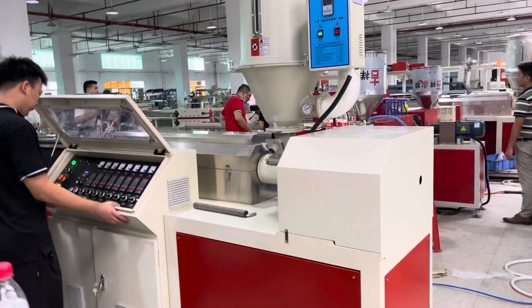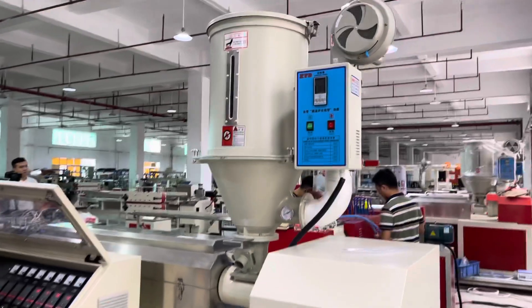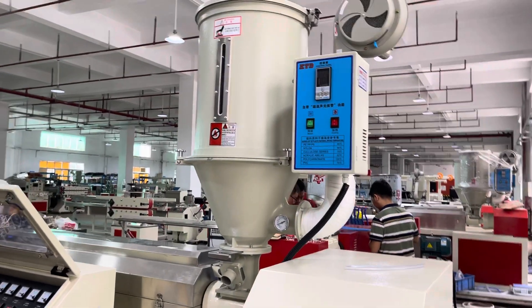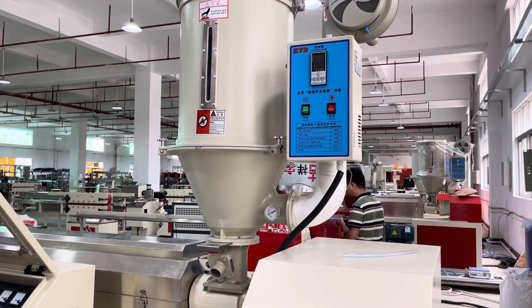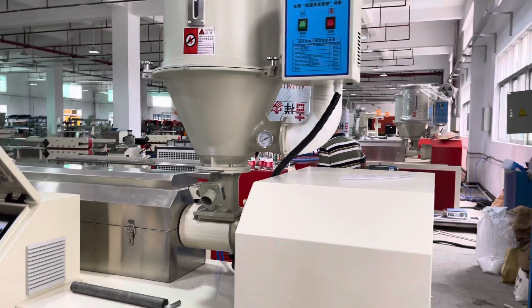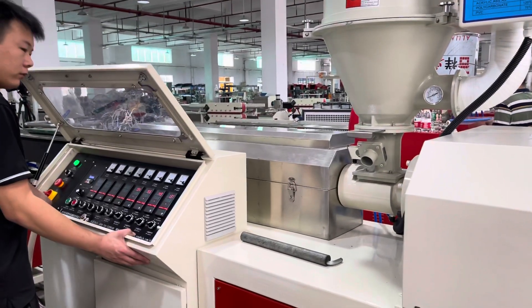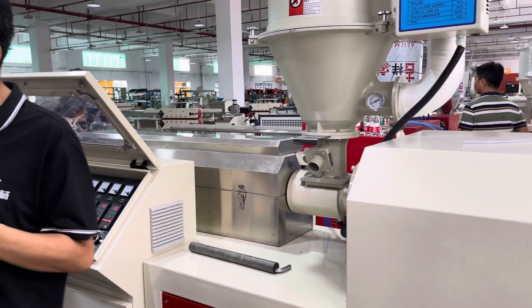Here you can see the main extruder. This is PVC raw material. It's different from other raw material — the PVC raw material needs no drying. After here you will see the extruder. You can see the screw and the barrel.